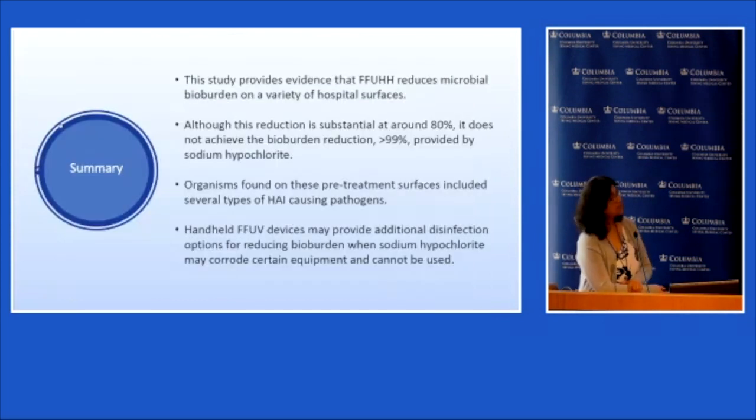So in summary, our study actually provides evidence that this device is effective in reducing the microbial burden on a variety of possible surfaces. And we saw that the reduction was substantial, more than 80% in case of the FFUV versus 99% for the sodium hypochlorite.